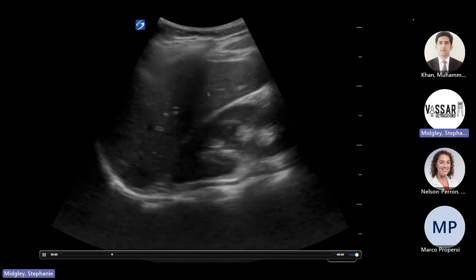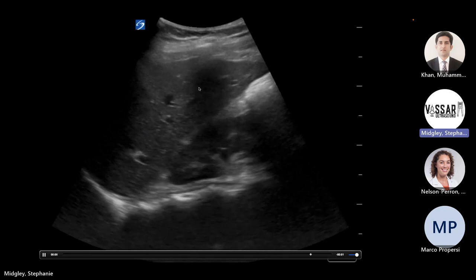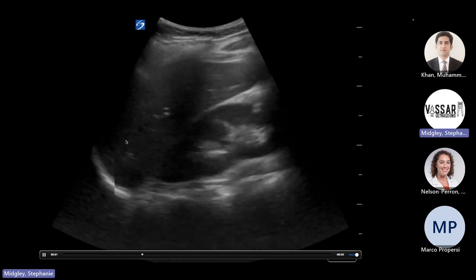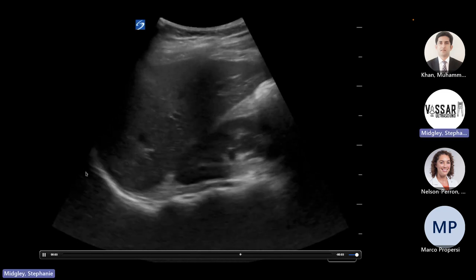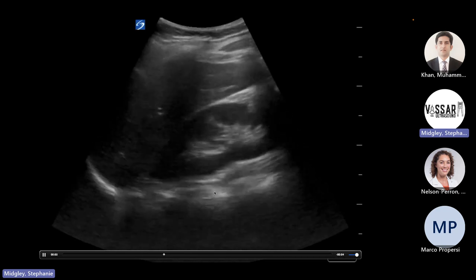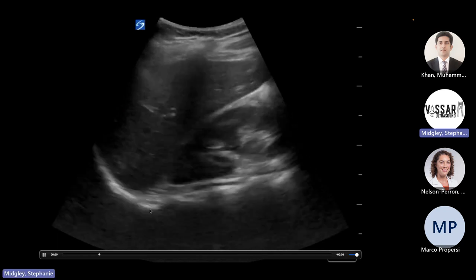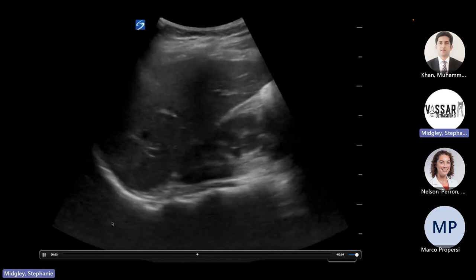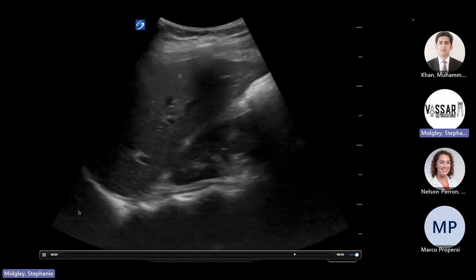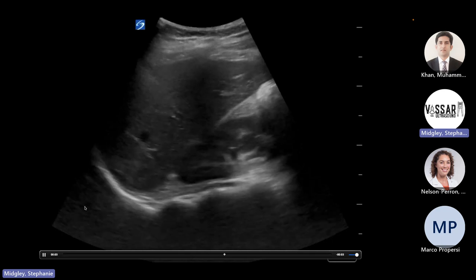This does have some rib shadow in the way. So we didn't twist enough, but that's okay. What else was I going to say? Oh, the other thing you notice, normal, right? You can see there's spine. So rib, vertebrae, right? And then it disappears. And we know your spine exists above your diaphragm. So this is telling me that the lung up here is normal and aerated.